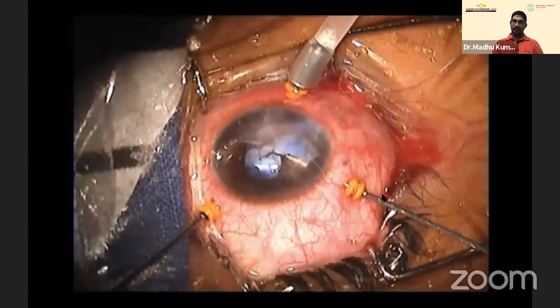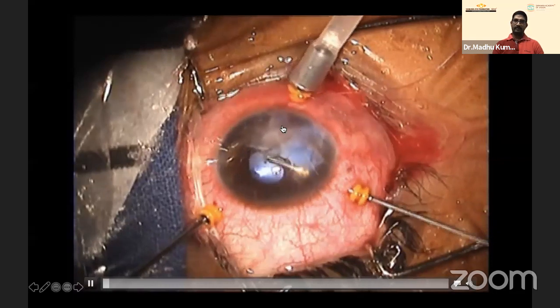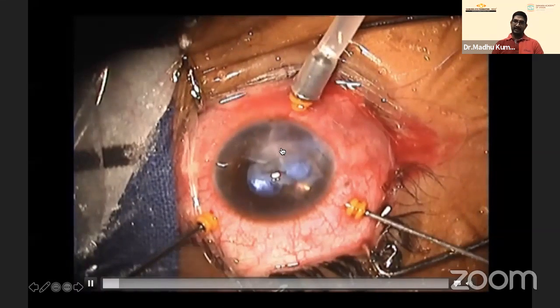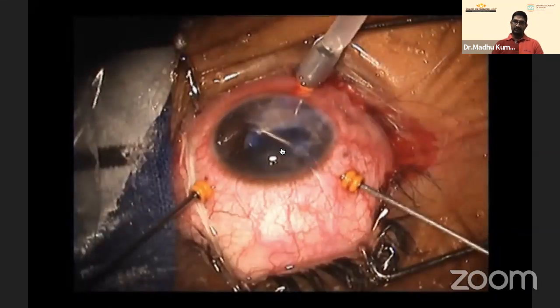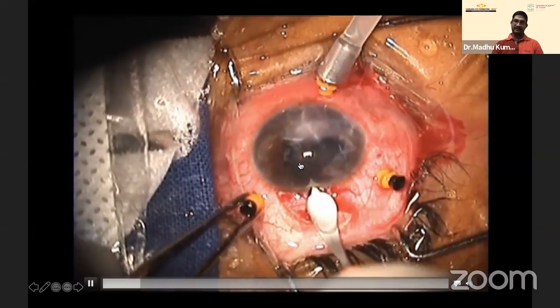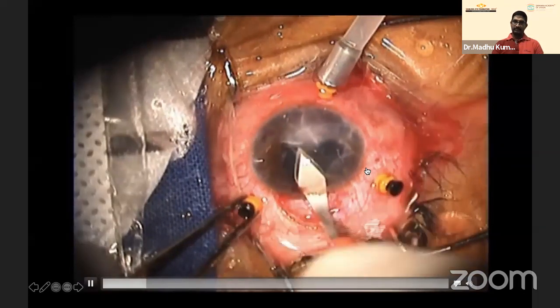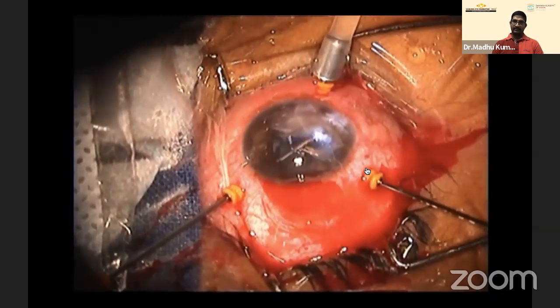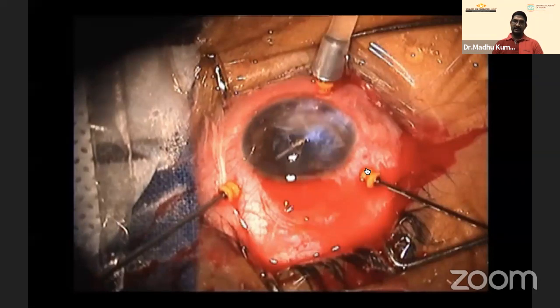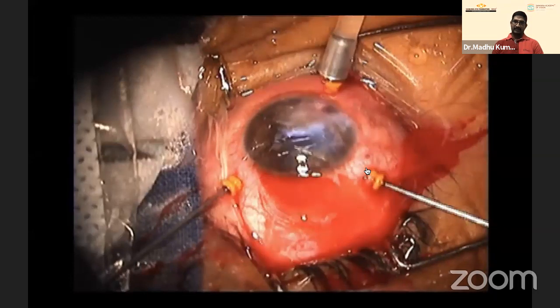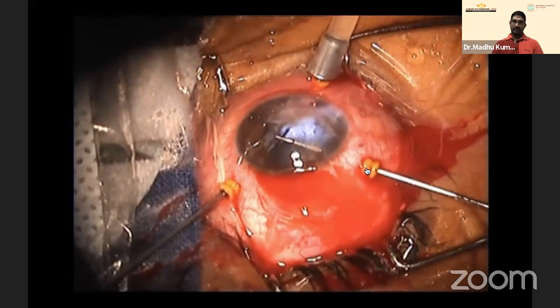The patient was posted for right eye lensectomy with foreign body removal. After one month of primary repair, the scarred cornea provided a limited window for visualization. The cataract remnants were removed, and a glass foreign body was identified stuck just behind the iris and gently dissected without causing excessive traction or damage to adjacent structures.